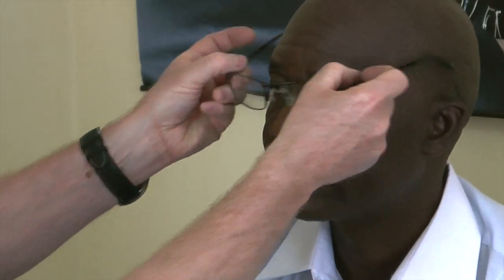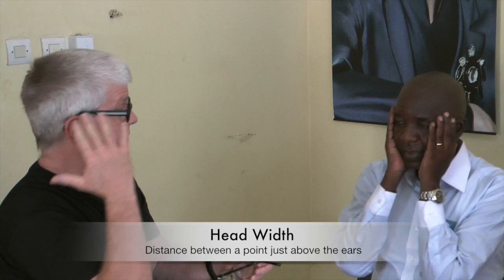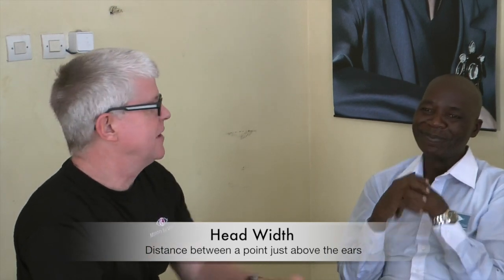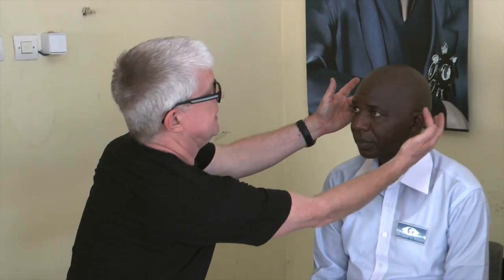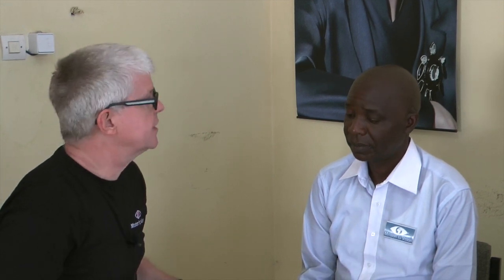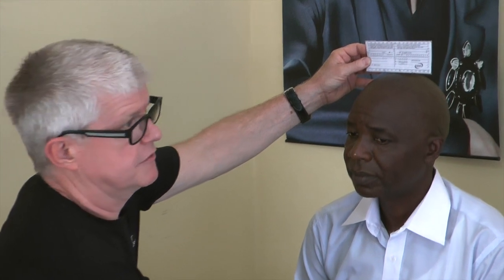Now, there are other elements of the adjustment that we need to consider, and one of those is the head width — everyone has different size heads. So we're going to measure the head width now. The head width is the distance between here and here. There are rulers that you can get which enable us to measure that very quickly, but we don't have one here for now, so you can use two rulers to get a rough idea.